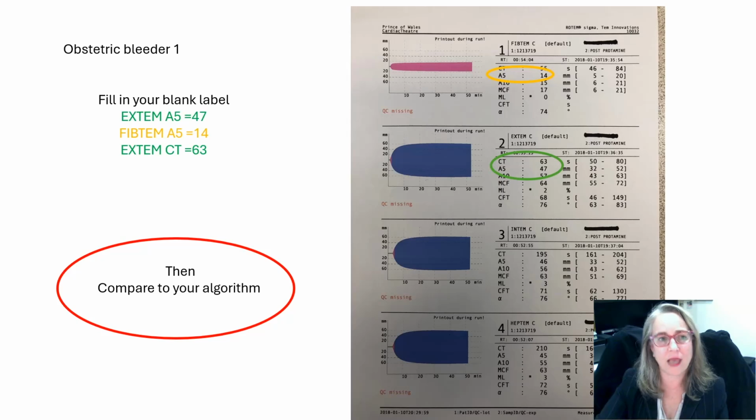Case number 1. Hopefully you've all printed out your algorithm and your stickers, or you've got the algorithm up on a screen somewhere so you can look at it, and a sticker that you could fill in. This is my first example. This is the printout the nurse would bring you.